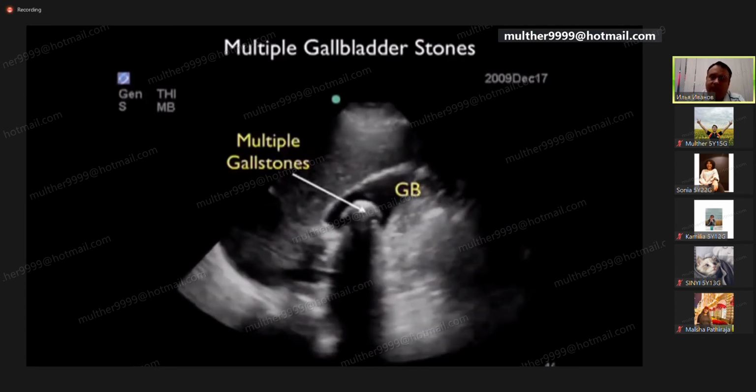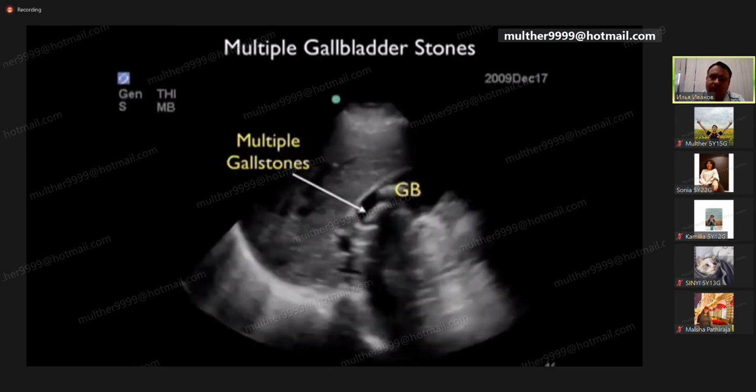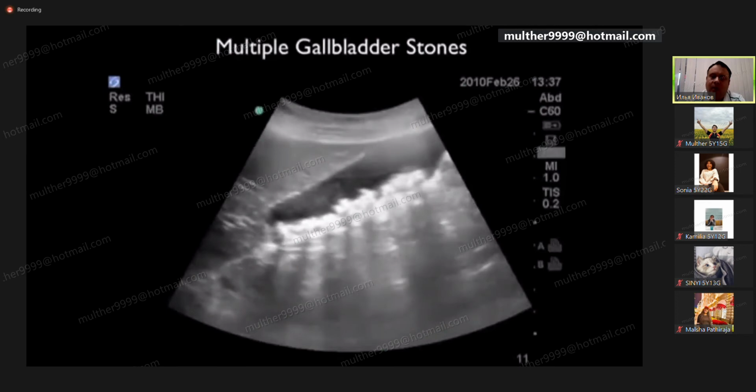Deposition within the gallbladder, forming multiple stones within the gallbladder lumen. And we can see here as we scan back and forth the multiple hyperechoic foci with a posterior acoustic shadow. Here's an interesting video clip from another patient. But this variant is the variant of the small stones. It's the real risk for the translocation through the cystic duct into the lumen of the common biliary duct.